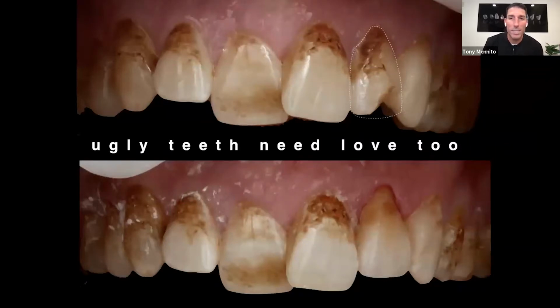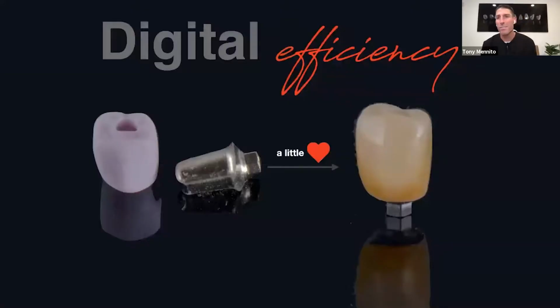And I love this because ugly teeth need love too, right? So we had number 10 that had root canal treatment. It had a large composite in it. It's not a pretty case, but this is one of my favorites because we got to camouflage this tooth and make it look like it blends into this patient's mouth. And we were able to do that. Actually, this was a super fun case. So emax is very versatile.